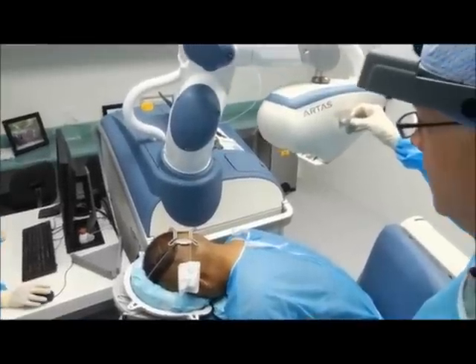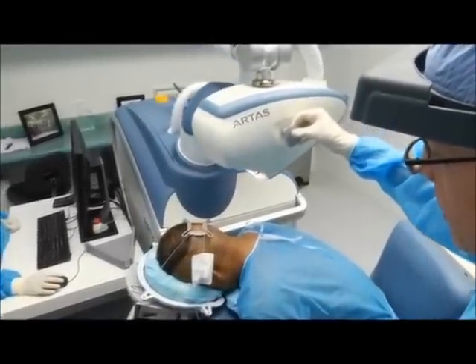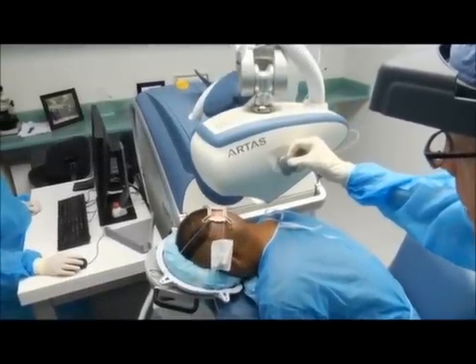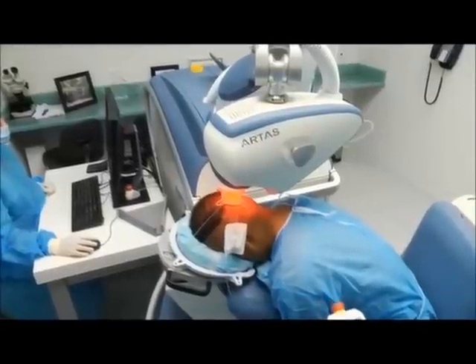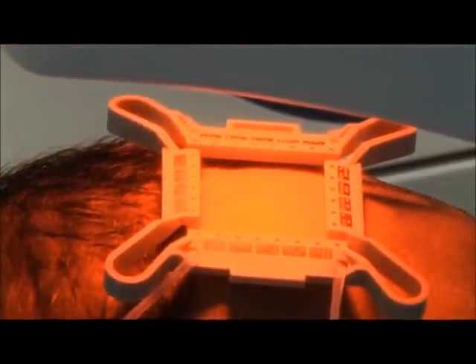Now we take the robotic arm, and there are two lights that need to be in focus. When the red lights are superimposed upon one another, we have the correct position for the robot to take over. The robot uses a 3D imaging system to align itself parallel to the direction of the hair follicles.